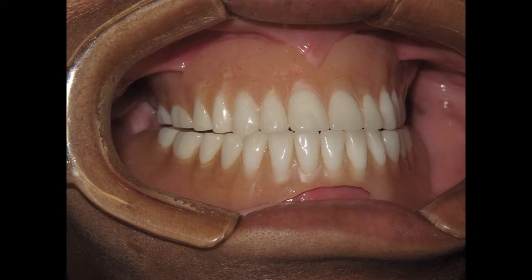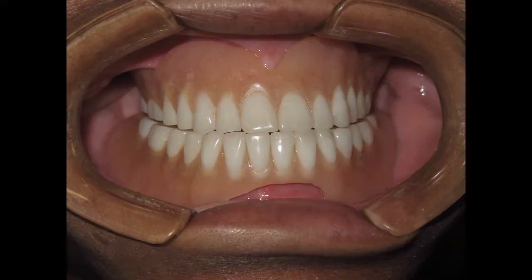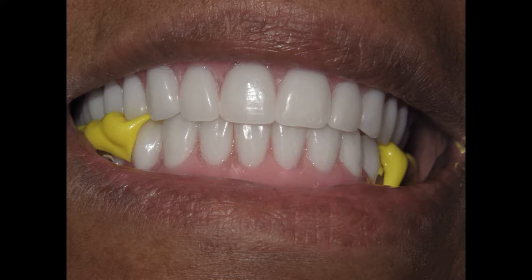As you can see in the images, the patient's existing dentures do not exhibit proper occlusion and this must be corrected. With improper fit or occlusion, the surgery cannot go forward. During the surgery, an ill-fitting denture means the trajectory of the implants and the bone reduction will be compromised. In this case, the restoring doctor went through all the steps of creating new dentures that can be used as spares during surgery. This followed conventional denture prosthetic setup and processing.